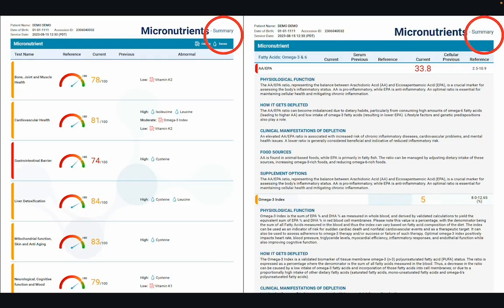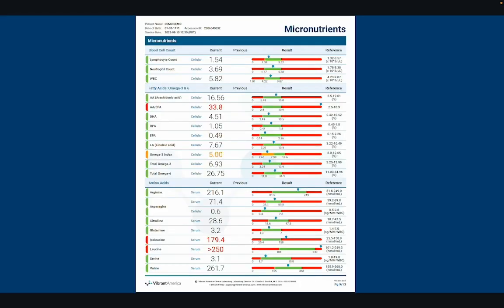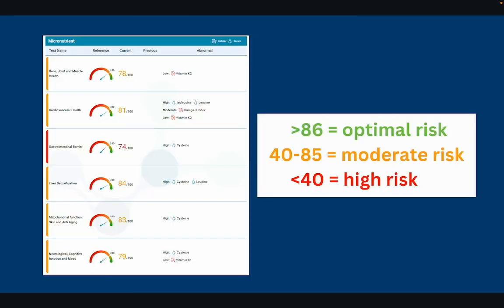The summary includes the micronutrients that are outside the reference range, along with six risk scores informed by those out-of-range nutrients. The full report lists levels of all 48 micronutrients along with blood cell counts. The risk scores classify micronutrients by blood system or structure function, scoring each on a scale of 0 to 100. Scores of 86 or above are green and indicate optimal risk. Scores between 40 and 85 are orange or yellow and indicate moderate risk. Scores below 40 are highlighted in red and indicate high risk of experiencing issues in that health area due to micronutrient deficiency or toxicity.